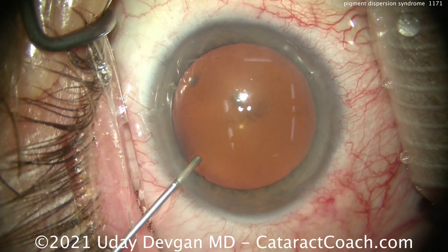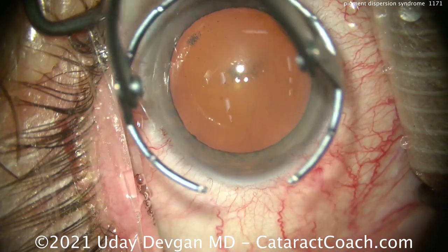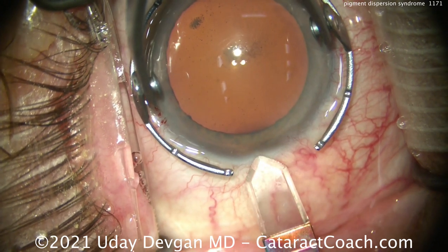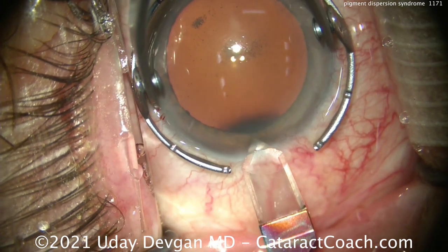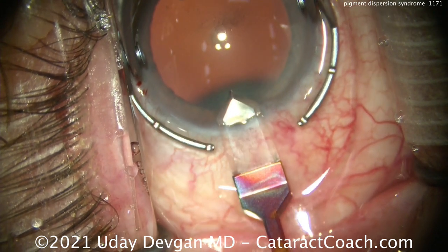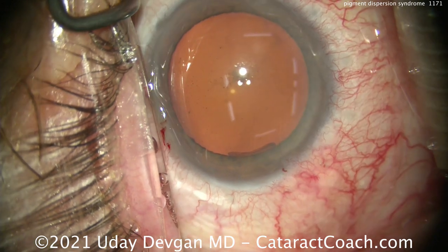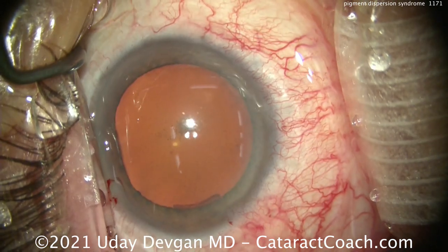In most cases, the Krukenberg spindle is of no visual consequence, so we'll do the cataract surgery as normal. You can see we've filled the eye with viscoelastic and we're going to make our main incision here with a diamond keratome, making a nice clean incision right there on the steep axis. We appropriately make the tunnel length just like that — looks great.